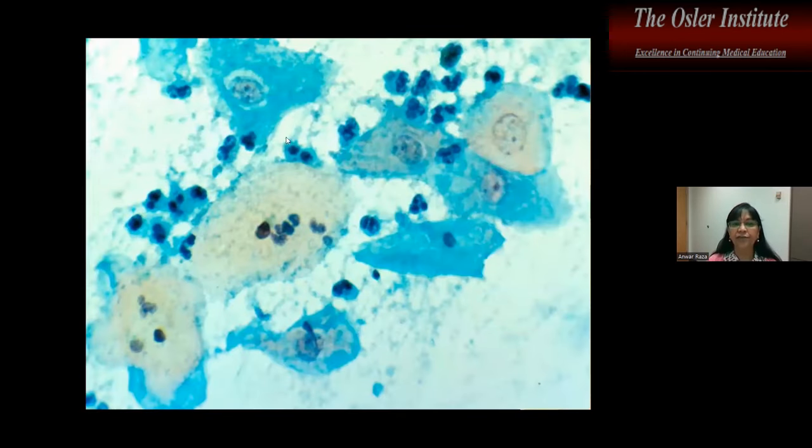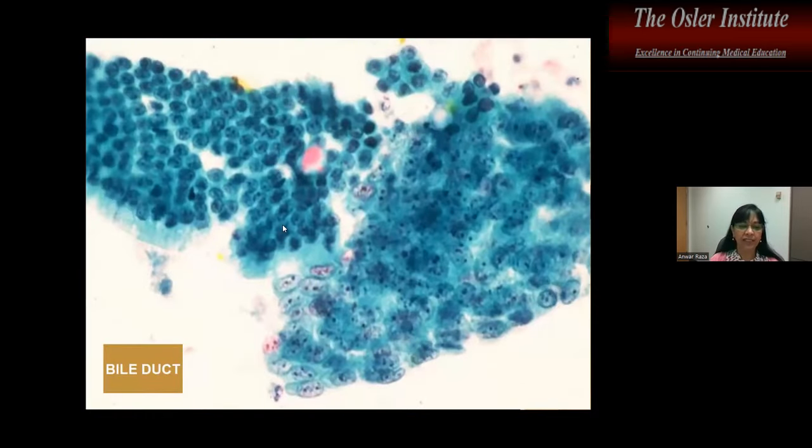Here you can see an inflammatory background, and the nucleus is enlarged, right? So the nucleus appears to be enlarged, but then notice around the nucleus, there's a little bit of a space. What happens is, in inflammation, there's enlargement of the nucleus reacting to this inflammation, but during fixation, it shrinks to give rise to this perinuclear halo. It's not a cavity, so this is just a halo, and that's something you see with reactive inflammatory states.